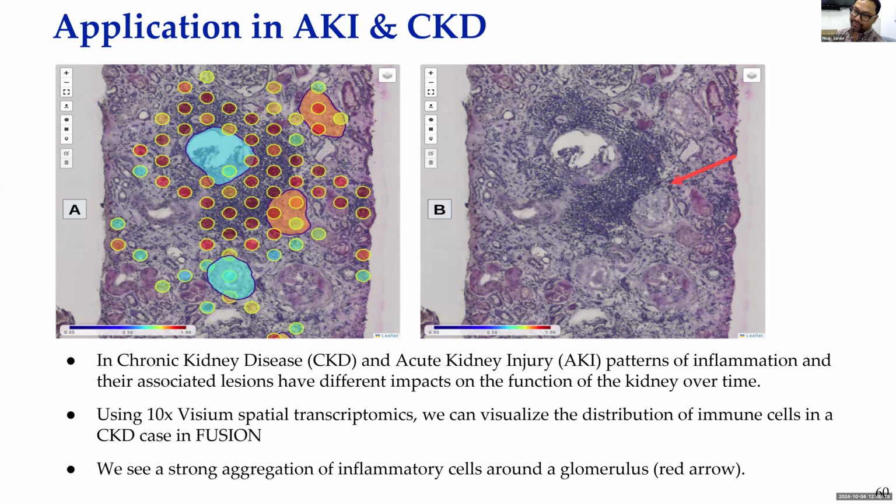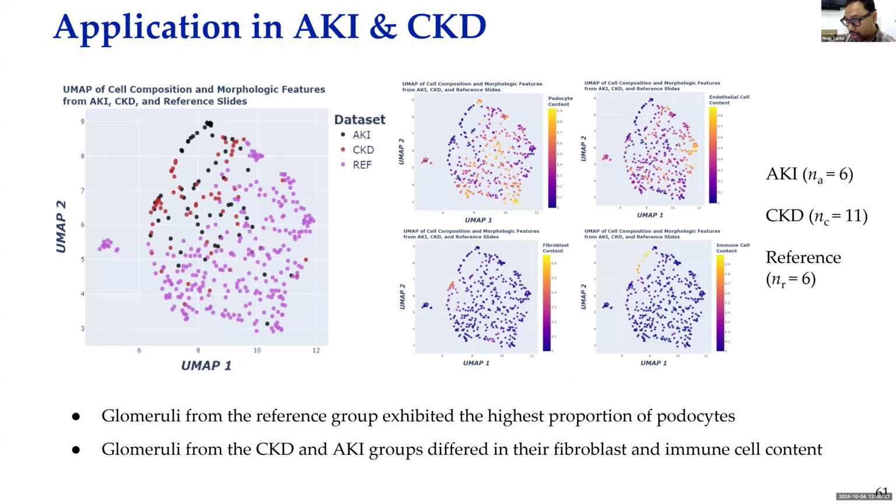We have some sort of junction in a tissue where inflammation is happening, and then immune cells go there to try to see what's going on. And then those acute changes are finally transferring to chronicity, right? So that's what we found this tool is capable of doing based on AI. And this is where we'll focus in coming years, and hope to work with some of you who are working in fundamental biology by bringing our tool.